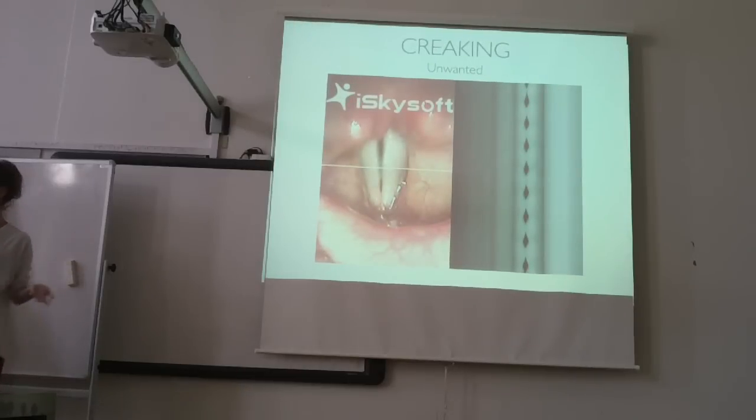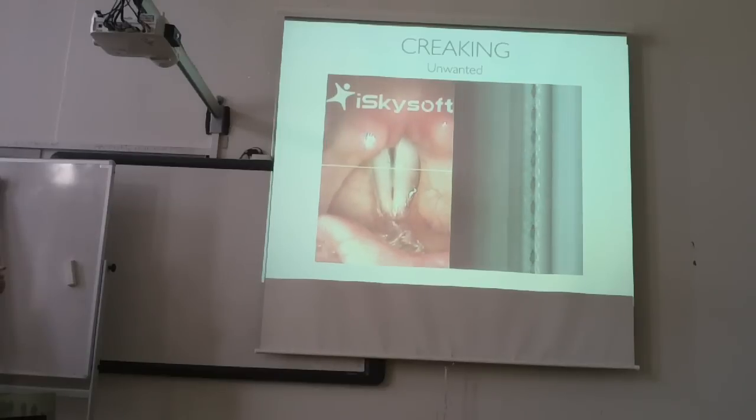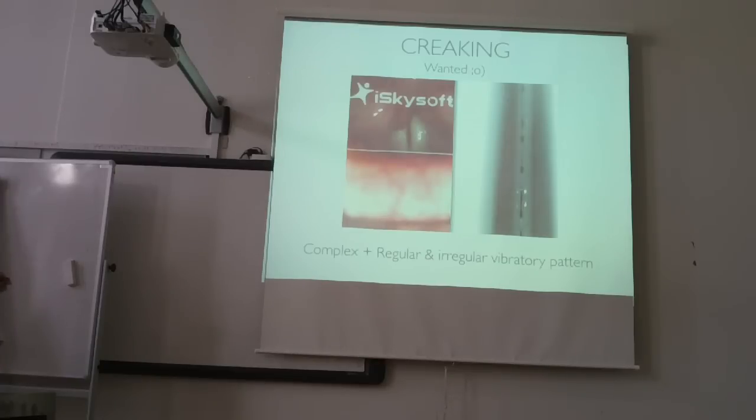This is an unwanted creaking. I was supposed to produce a beautiful tone and then suddenly it creaked. And you can see here that during the split second there was a complex vibratory pattern. This was a wanted creaking, not unwanted.